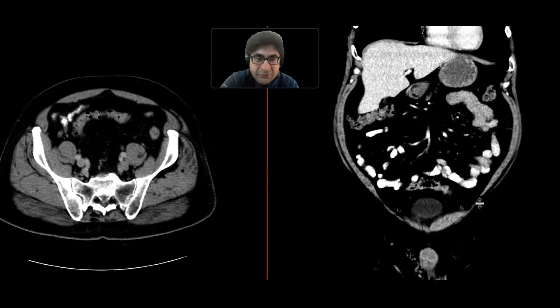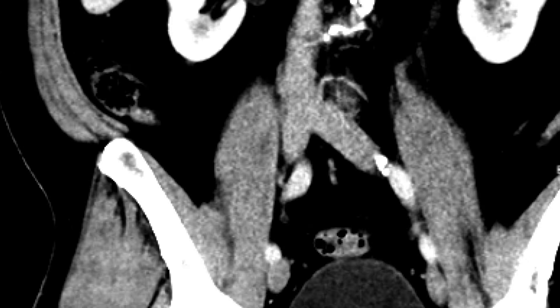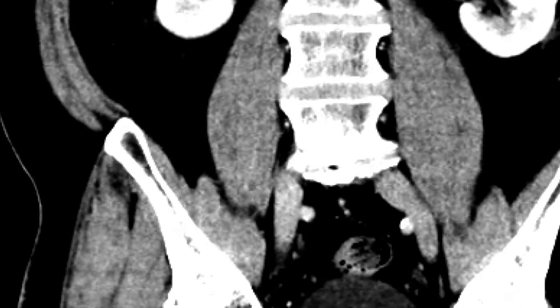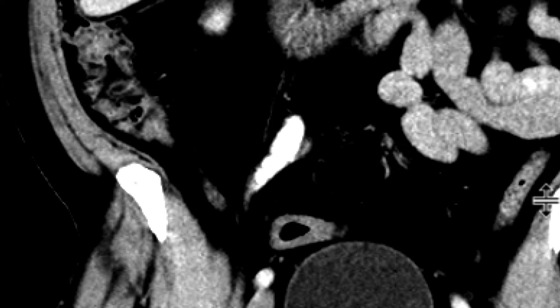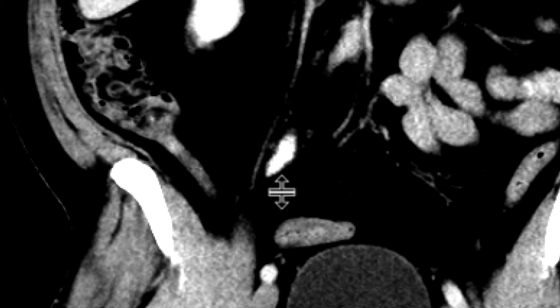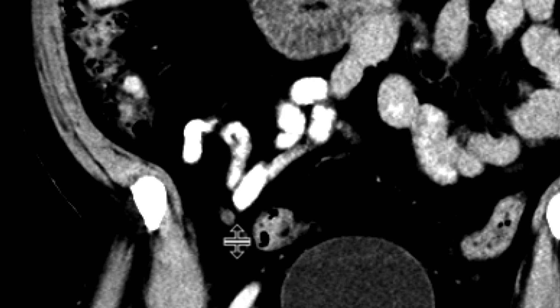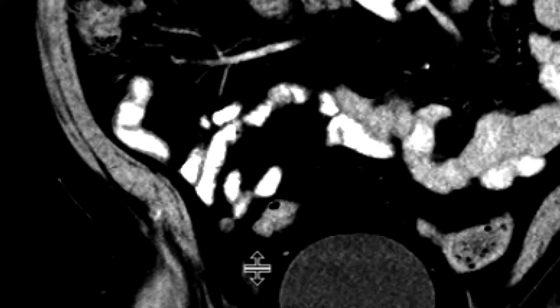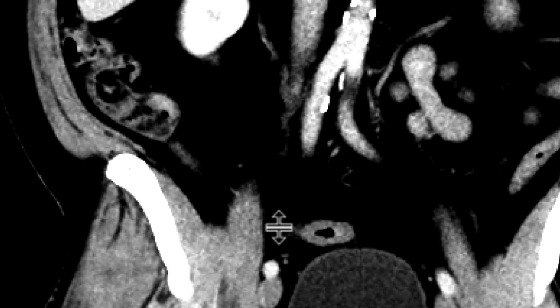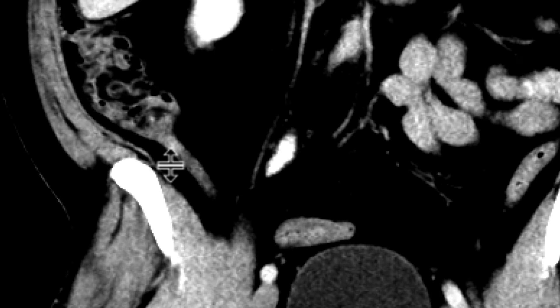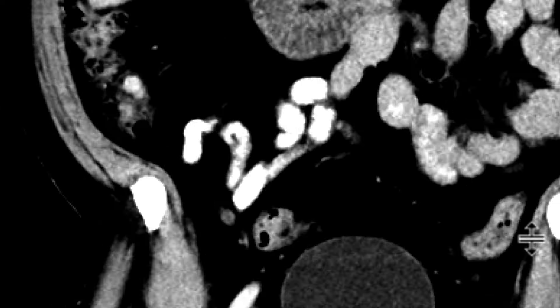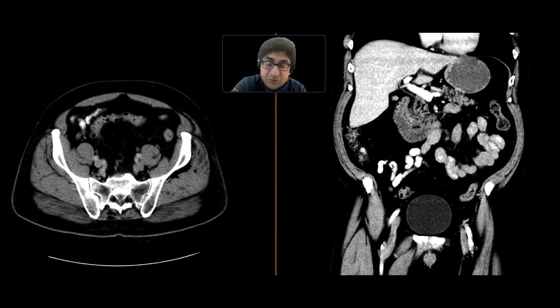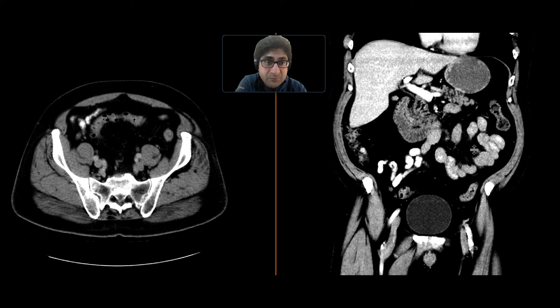That caught our eye as we were looking through this. We can look at this on different kernels as well, and I think this shows the finding pretty nicely. You can see the appendix in the right lower quadrant — most of the appendix has a low-density appearance all the way out to the distal appendix, but as it goes more proximally and meets the cecum, there is definitely a very segmental region of higher attenuation.